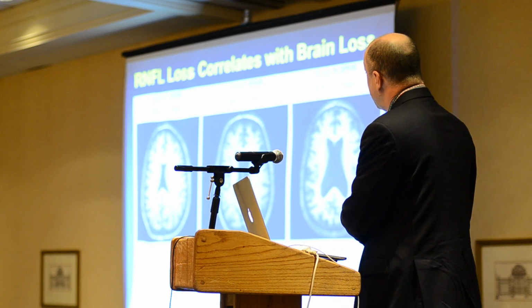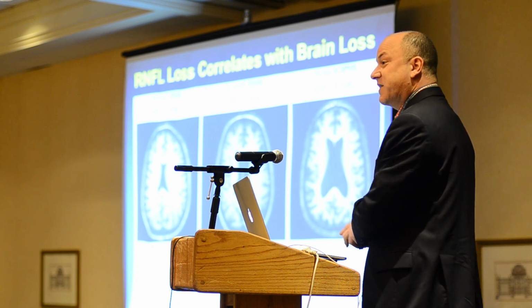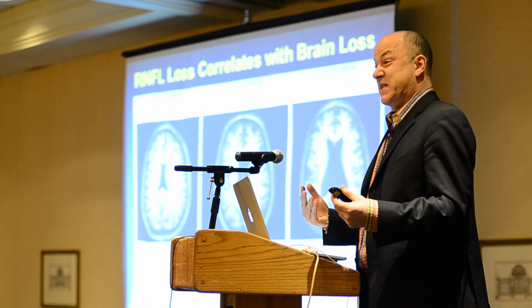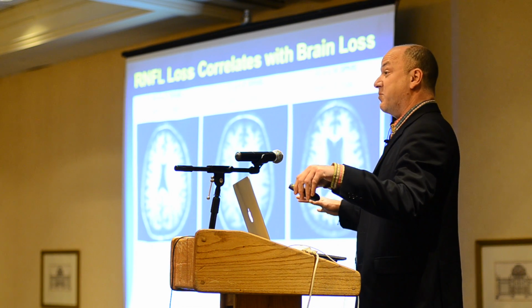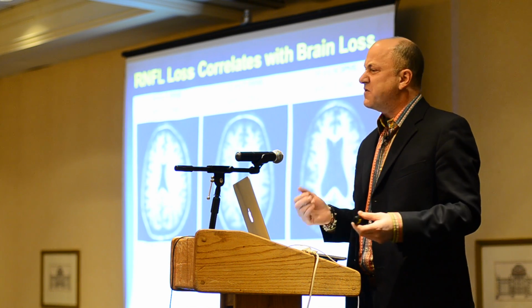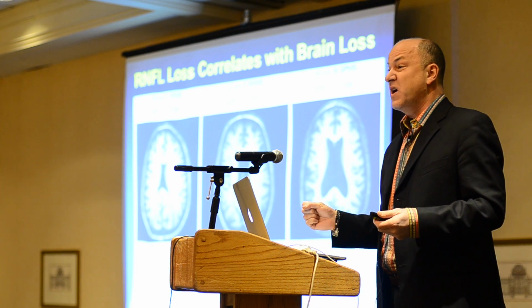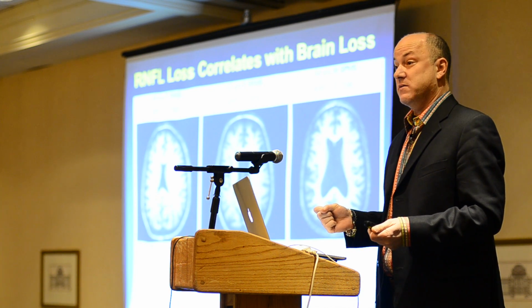And here you can see that fraction going down in proportion with the shrinkage of the optic nerve. So now we have two elements that we want to see. We have a measure that can be applicable to everyone, and we now also have a measure that correlates with something that's very difficult to capture otherwise. That is brain atrophy, which is a strong measure of disability in MS.